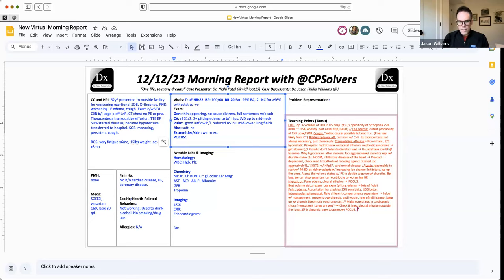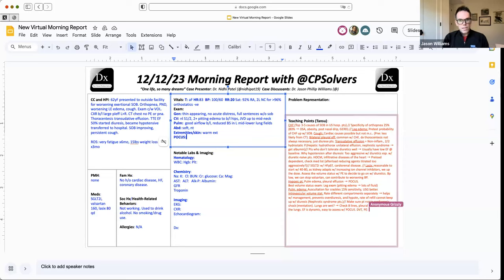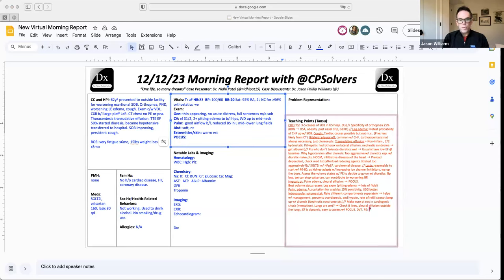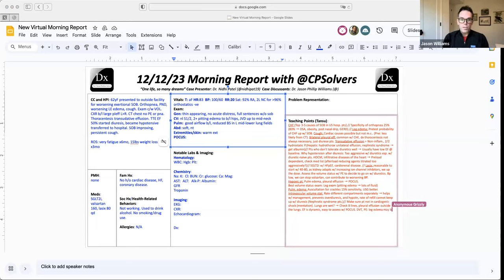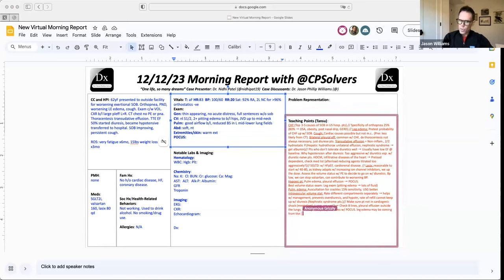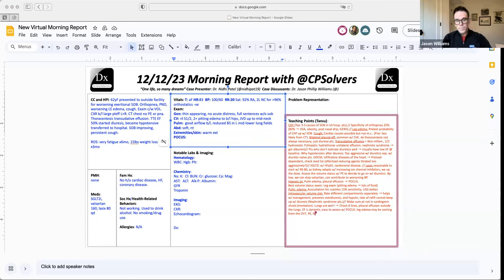We probably shouldn't forget DVT and PE as well in our differential, especially if that IVC is empty. This doesn't suggest the leg edema may be coming from the right atrium. And we should look at the other pipes, like the femoral veins and popliteal veins, make sure there's no clot there. Should maybe look at the heart, make sure there's no right heart dysfunction now. Maybe she developed a DVT and PE and now has some severe right heart dysfunction. And then finally, if she's got pleural effusions, make sure we haven't developed any pericardial effusions causing tamponade. So those are a couple of things I'm looking forward to on our POCUS exam.